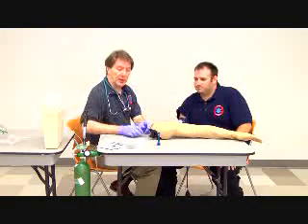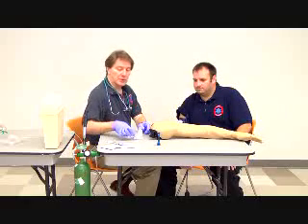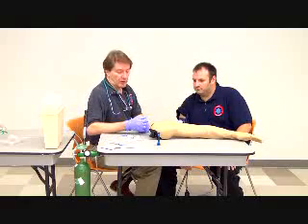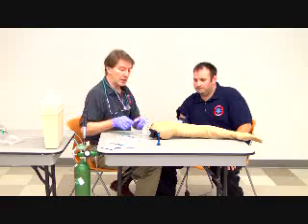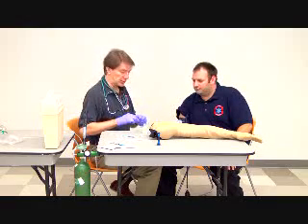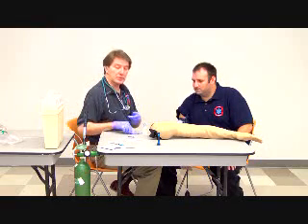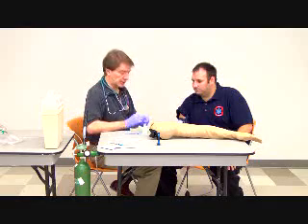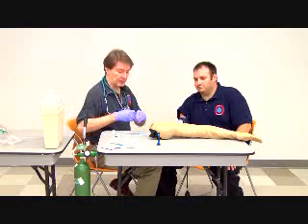I'm going to assemble all of my equipment, which would include the epinephrine, a tuberculin syringe, alcohol preps, and a Band-Aid. I'm going to check my epinephrine for the 5 rights to make sure, of course, it's the right med, in date, right concentration, and so on and so forth. I'm going to make sure that I have a tuberculin syringe as opposed to an insulin syringe. And I'm next going to prep the top of my vial.